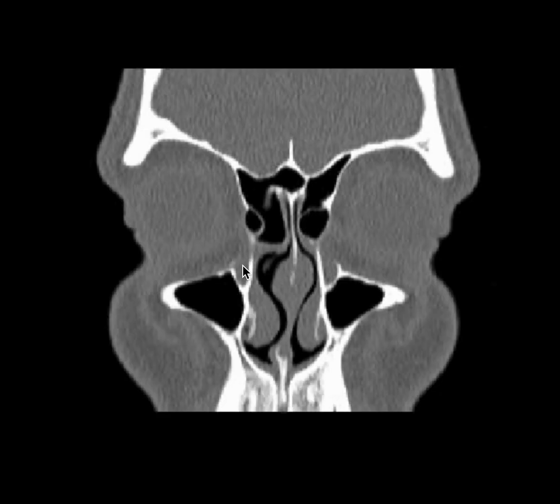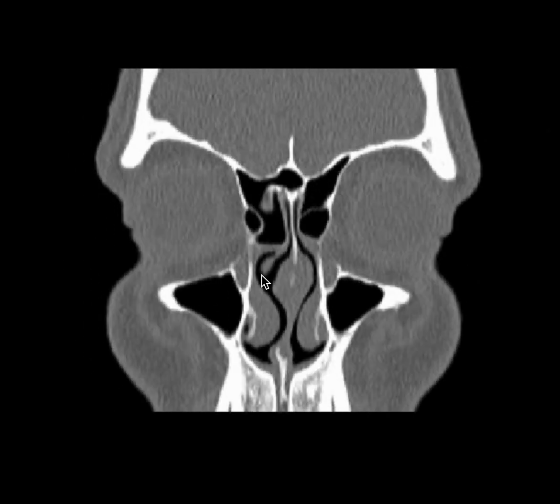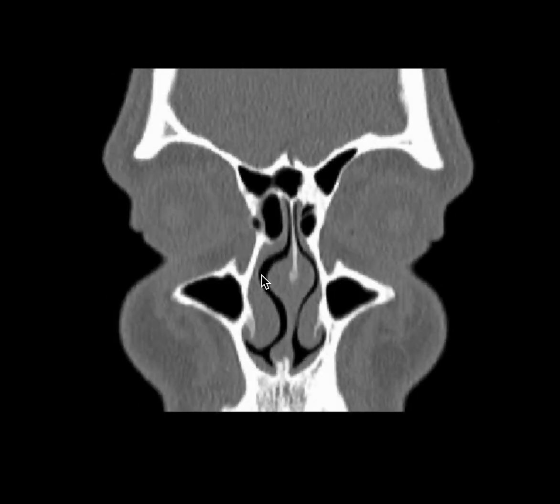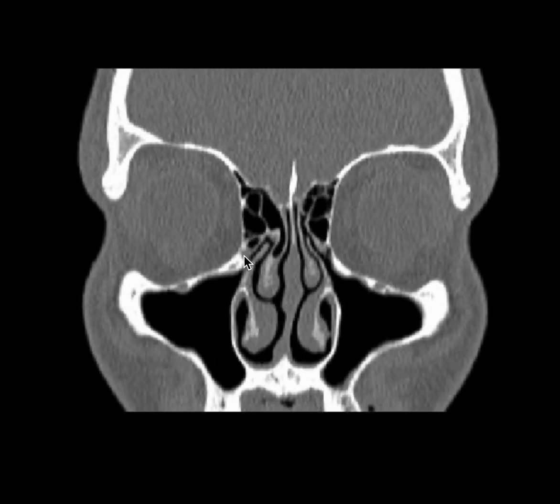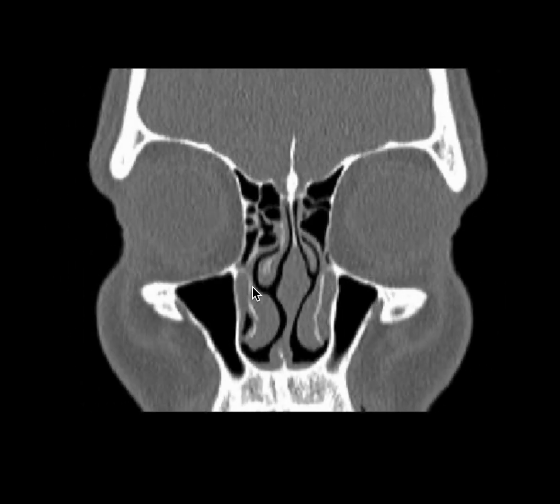What you see over here is the nasolacrimal sac and duct. I am going to scroll anterior and posterior. See this — can you see the whole segment coming, flowing up and down? That is the duct. It starts from here and it opens here under the inferior turbinate.